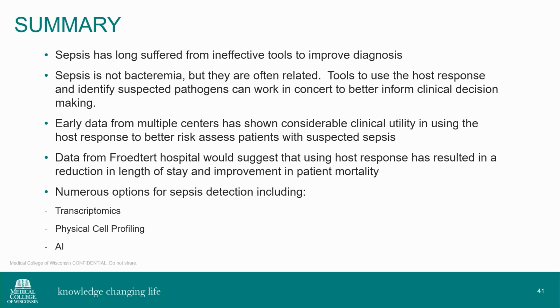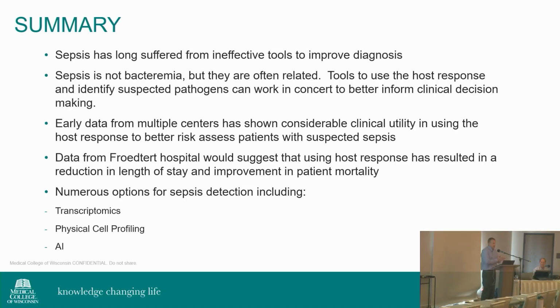So this is a great question. It's a test that's currently approved for use singly. And we've seen IntelliSep, we've seen MDW, we've seen Septicyte, and we've seen TriVerity all be cleared for a single-use measurement. The key question is, what patients should you be doing it on, and how broad do you want to go with these patients? Because there's huge cost implications to this.